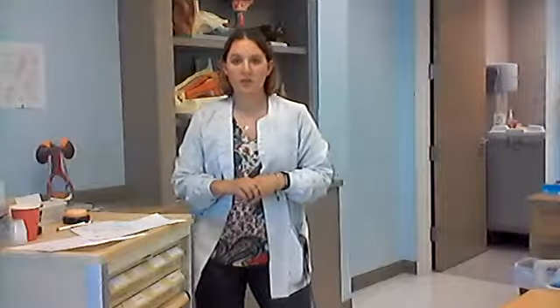So to begin our checkoff, you would go ahead and do your sites. You'd list all your sites for all those 3 injections. Please see the previous video in order to go through your sites. After your sites are done, you're now going to start your checkoff with your 6 rights. So state your 6 rights to your instructor. The right patient, the right medication, right dose, right route, time is now, and document at the end.